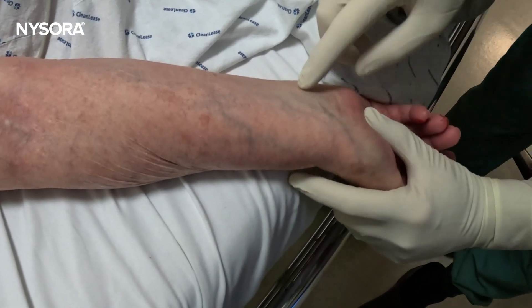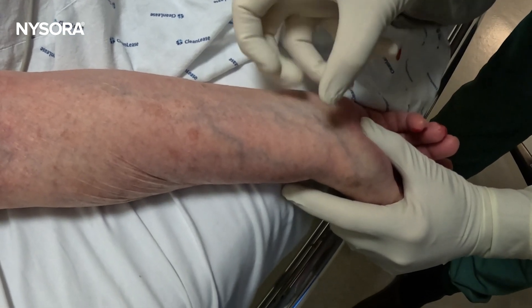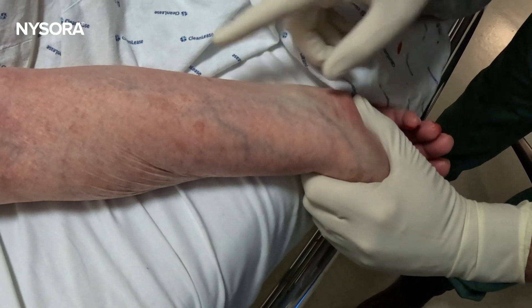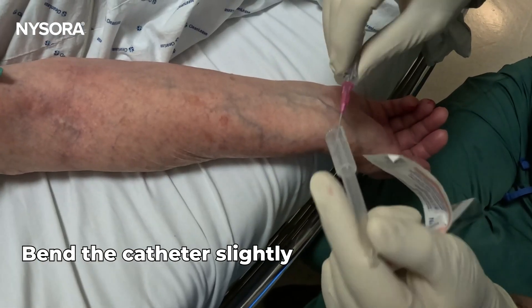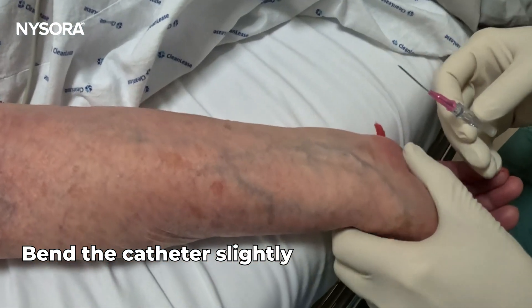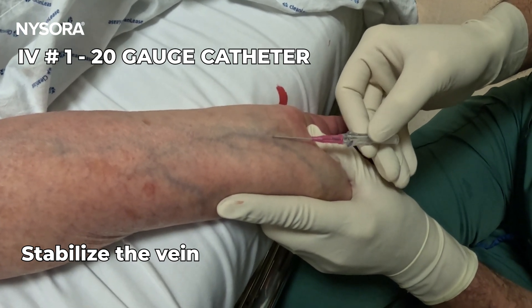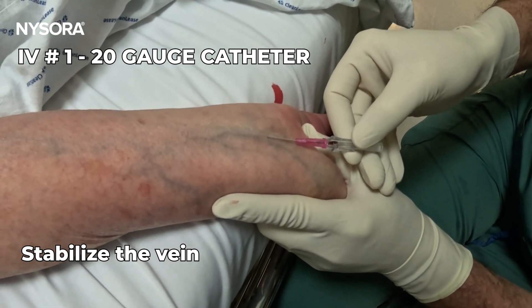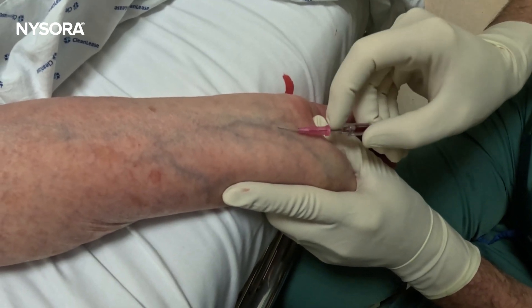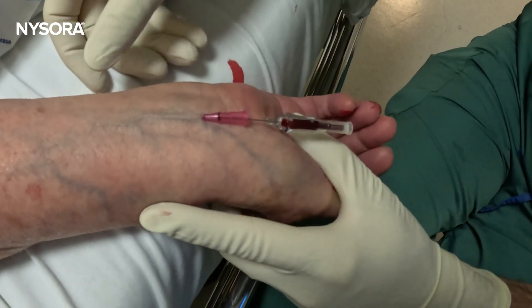Here we are lucky — we can see a vein that is fairly straight and has a tributary which makes it stable. If we tap on it, I think this would be a really good choice for intravenous access. I'm going to bend the catheter slightly so we have the leverage, stabilize the vein first underneath the skin, then lift the angle up and enter the vein. There we go — I can advance this further and feed the catheter inside. We now have one IV access that is workable.